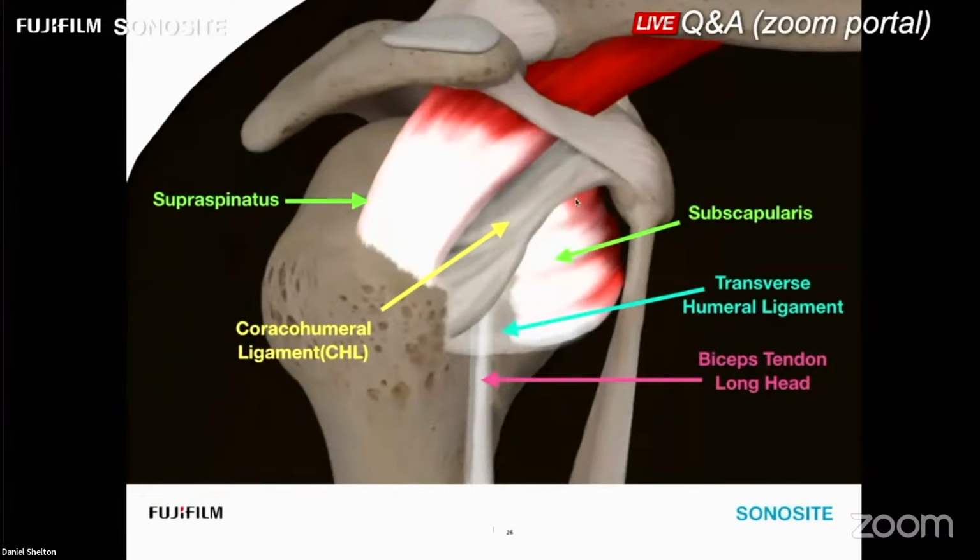A lot of the strength, in fact, more often relies on this coracohumeral ligament in conjunction with the transverse humeral ligament, which is here. It's very broad and is more of an extension of the anterior subscapularis fibers. So anterior subscapularis, which we evaluated last week, shares fibers and jumps over the biceps groove to create mostly that transverse humeral ligament, which blends in with the coracohumeral ligament. These ligaments are the things that stabilize the biceps. So other things that may be pain generators or sources of instability in the shoulder, and various other things to look for, don't forget about these ligaments surrounding the biceps.